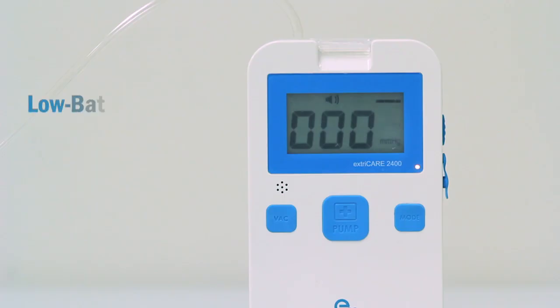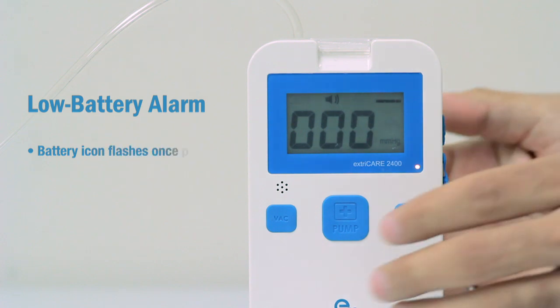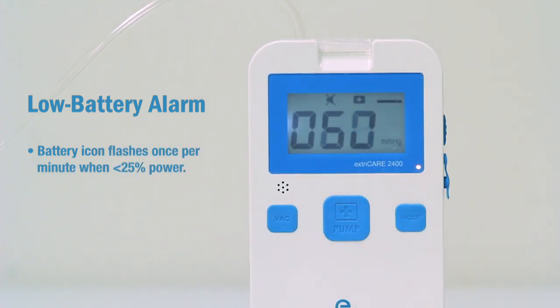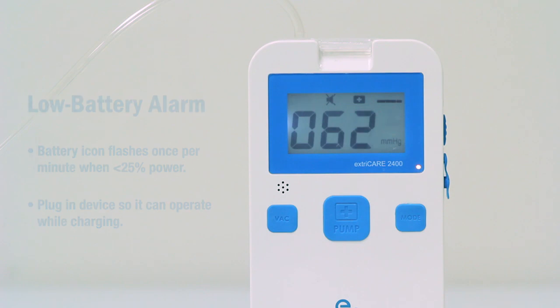When there is less than 25% power remaining, the battery icon will flash and the alarm will sound once per minute. If the icon is flashing, it is recommended that the ExtraCare be plugged in so that it can both operate and charge simultaneously.